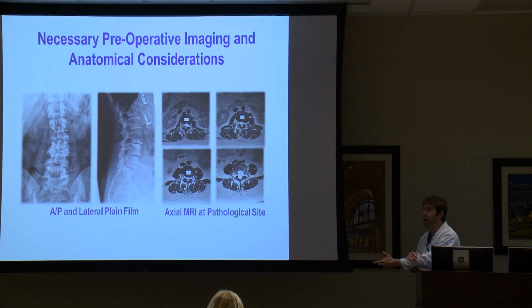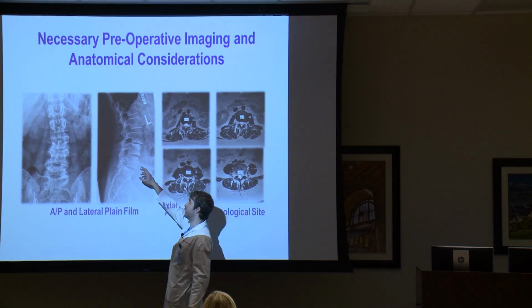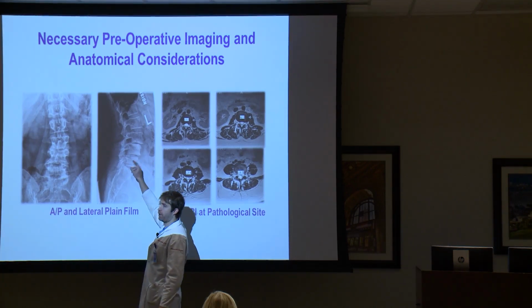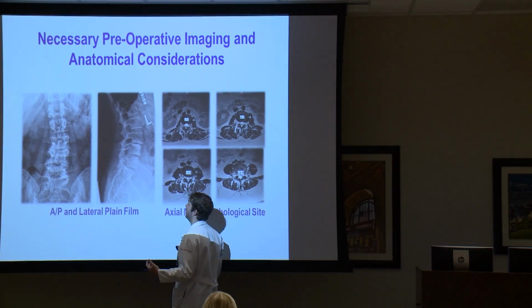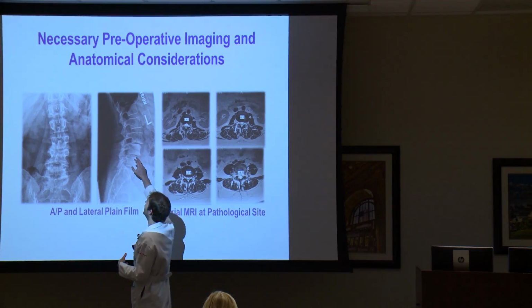But the other option is to use that in your revisions. And I know that I've done it, and Dr. Kimmel has done it. If someone has a posterior spinal fusion with a bunch of screws and a ton of scar tissue down here at L4-5 and L5-S1, and it's some system that Dr. Jackson invented and no one knows how to get it out, ask me how I know.